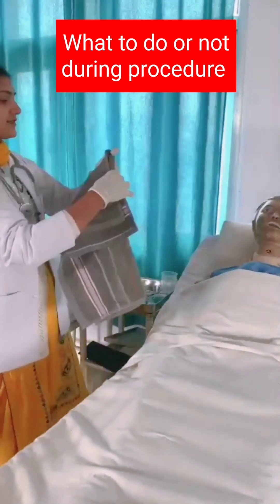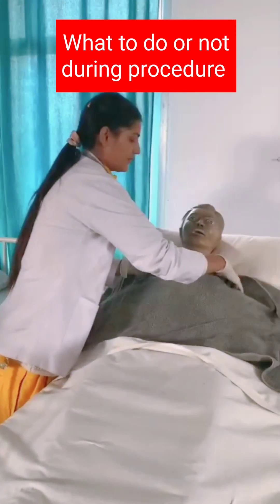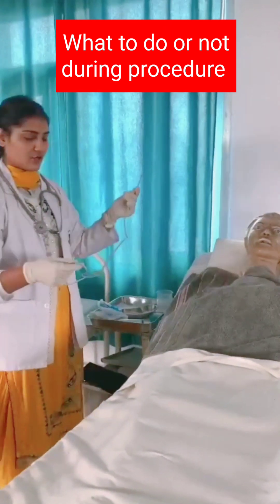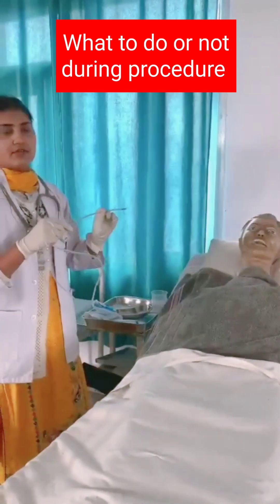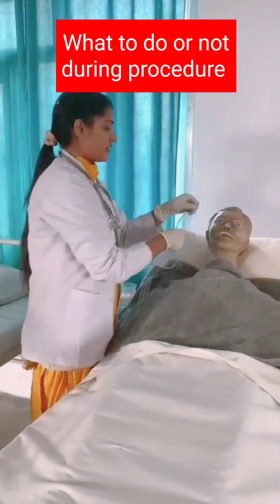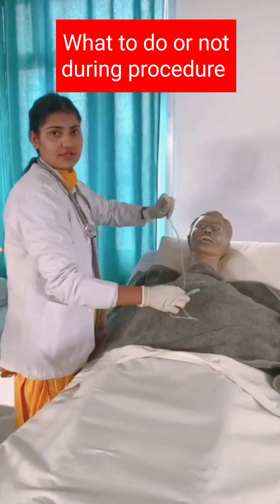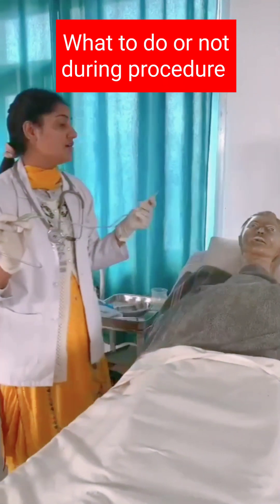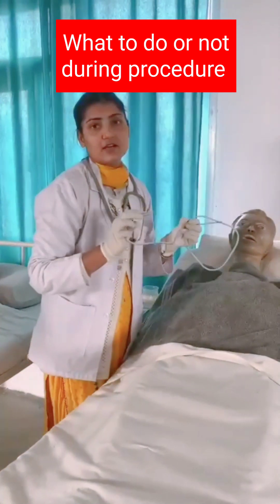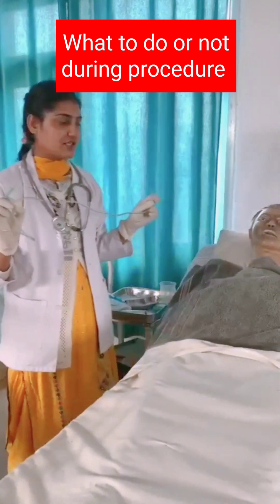First of all, I will place the towel on the chest under the chin of the patient to prevent any contamination and spillage. Then I will open the packet of the nasogastric tube and measure the length of the tube from nose to ear, and ear to stomach. Whatever the actual length will be, I have to mark that length on the tube so that when I administer the tube inside the nose, there will be no confusion about how much to insert. This is the major purpose of measuring the length.